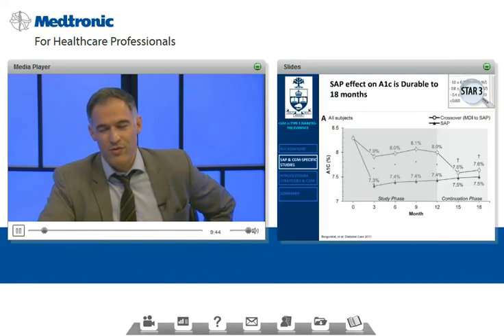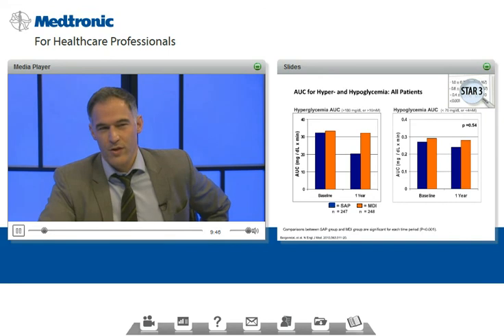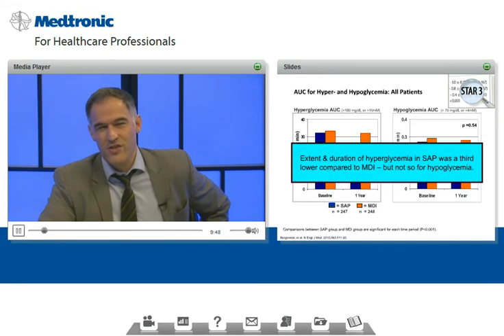So maybe to prevent hypoglycemia further, we need more measures. But the other interpretation is that this was a group that frankly was having very low levels of hypoglycemia, like about 1/4 of the rates that we saw in the Diabetes Control and Complications Trial, DCCT.